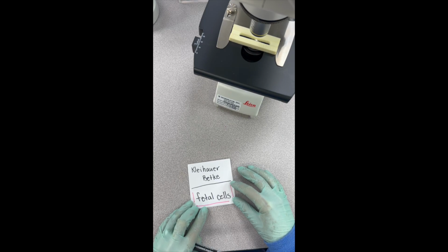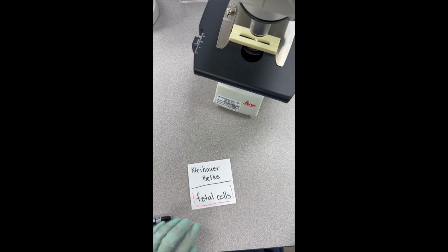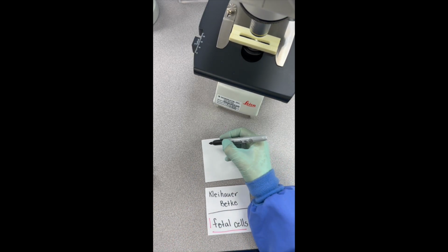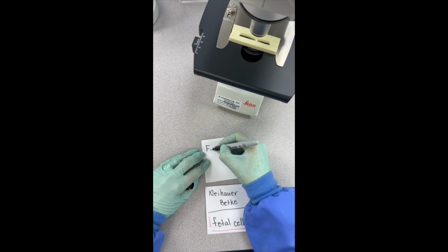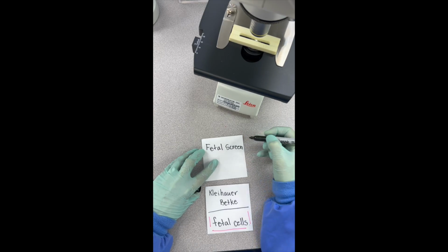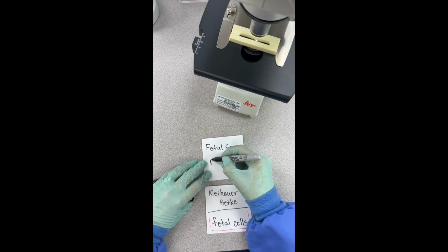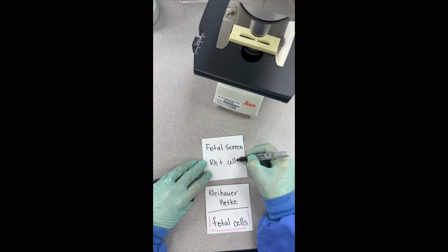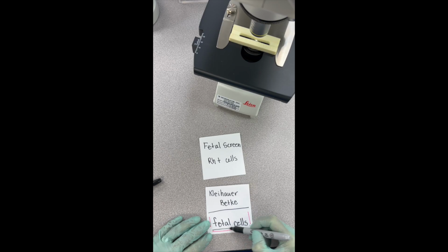And that's a huge difference between our fetal screen and our Kleihauer-Betke. Our fetal screen detects what? It detects Rh positive cells, where our Kleihauer-Betke specifically detects fetal cells.